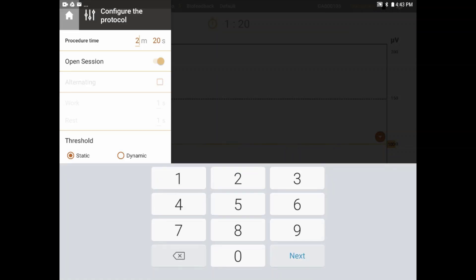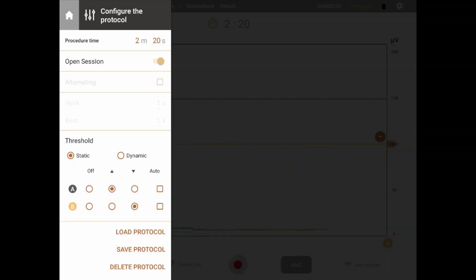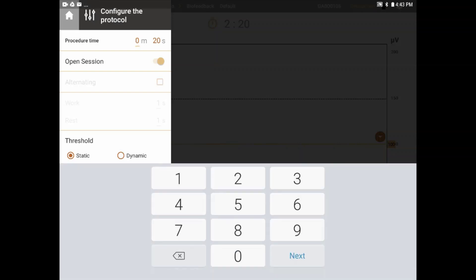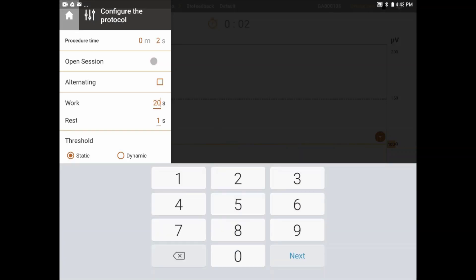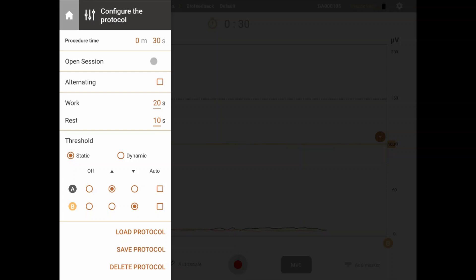Session duration can be entered at the top of the menu — click and enter the amount of minutes and seconds, then click anywhere on the screen to close the dialog box. This will adjust automatically as time will be rounded up to fit the work and rest timings if necessary. Setting session duration to zero allows you to run an infinite session and stop it when you please. Sessions may be stopped at any time even if a session duration is set. To adjust work and rest times, click on the value next to the corresponding line and enter the desired value. Note that in pattern view mode, there are no work and rest times and the session is always open.